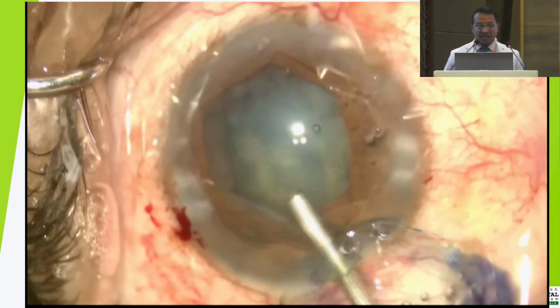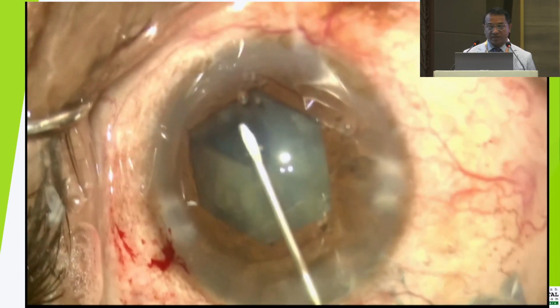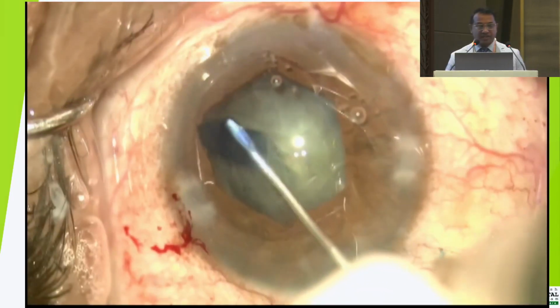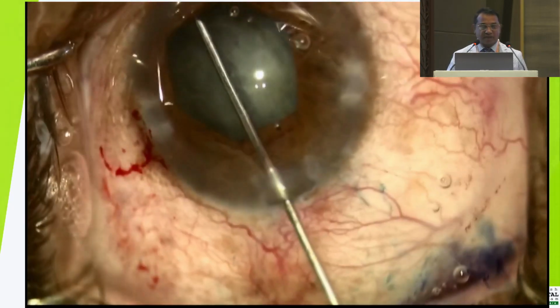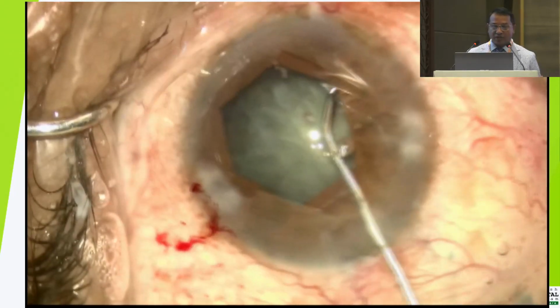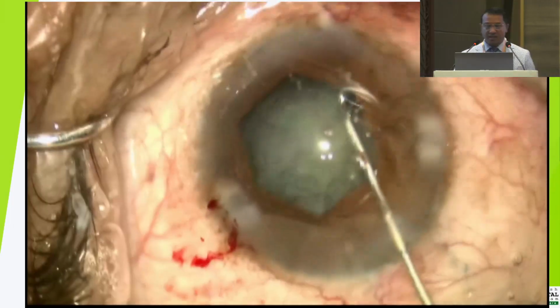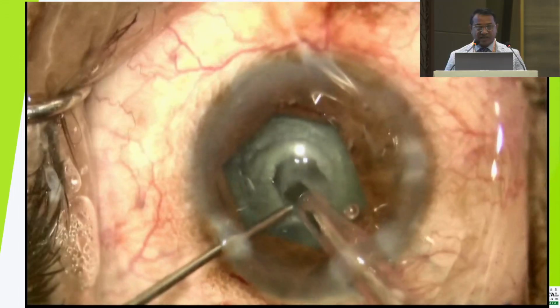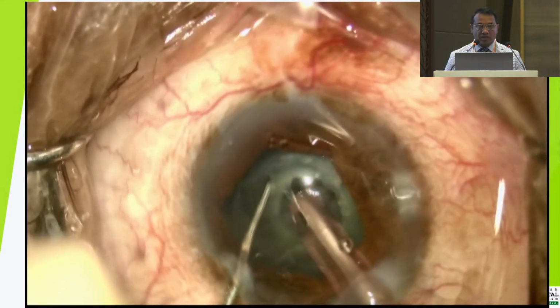The advantage of this technique is that it does not allow the anterior chamber and pupil to collapse, and an optimum size rhexis is being created with the 26 gauge bent hydrocannula. Again, I am performing hydrodissection. Usually I prefer the Akahoshi small bent hydrocannula, and the advantage of this cannula is that I can go up to the equator. Now the sculpting is proceeding, again with a low bottle height and low infusion flow.